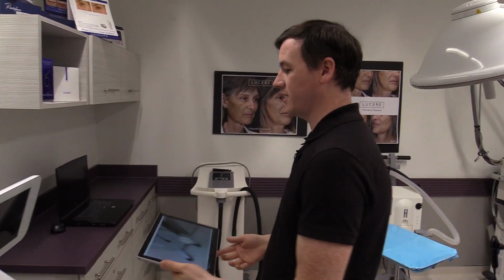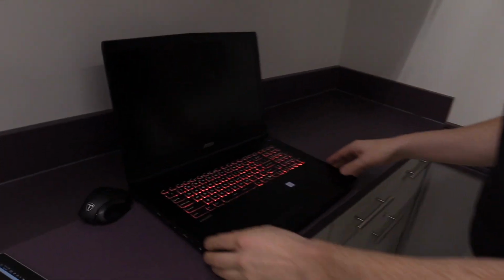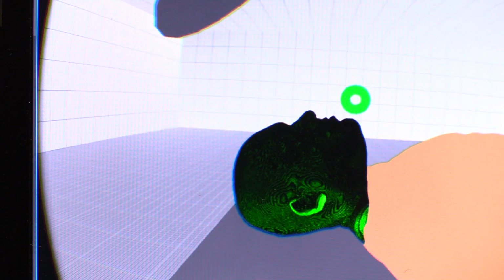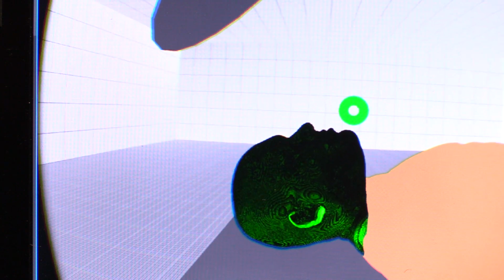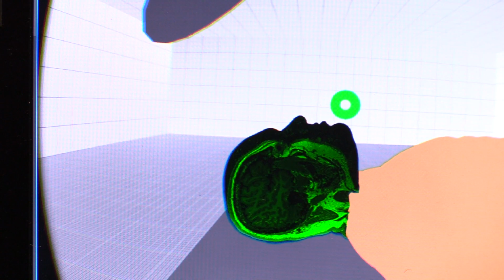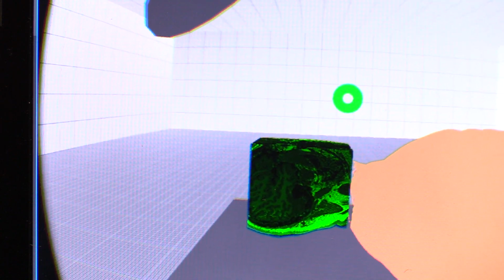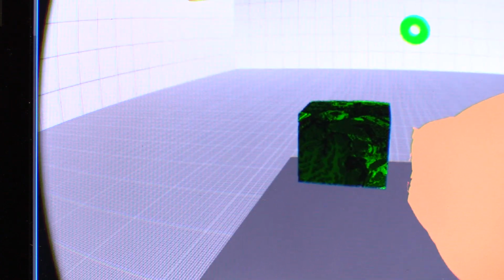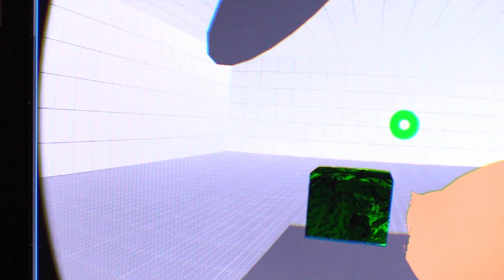Now I'd like to show you something else. We have a virtual reality component, which I'm going to show you over here on this computer. In virtual reality, we can explore diagnostic images such as this MRI in 3 dimensions. Traditionally, a radiologist would look at 2-dimensional slices and they would see only a piece at a time of the MRI. We, in this case, can look at it in 3 dimensions and actually scroll through it in 3 dimensions. This allows a radiologist to see things in true 3D. That means that we can see the contours of a tumor, for example, and other pathology.